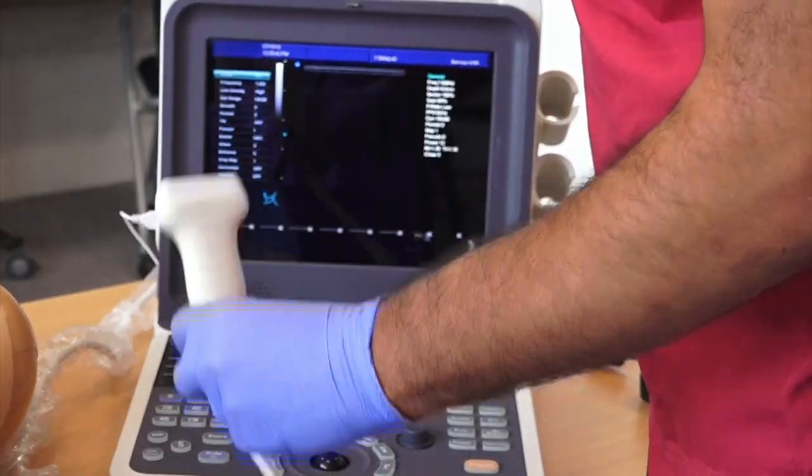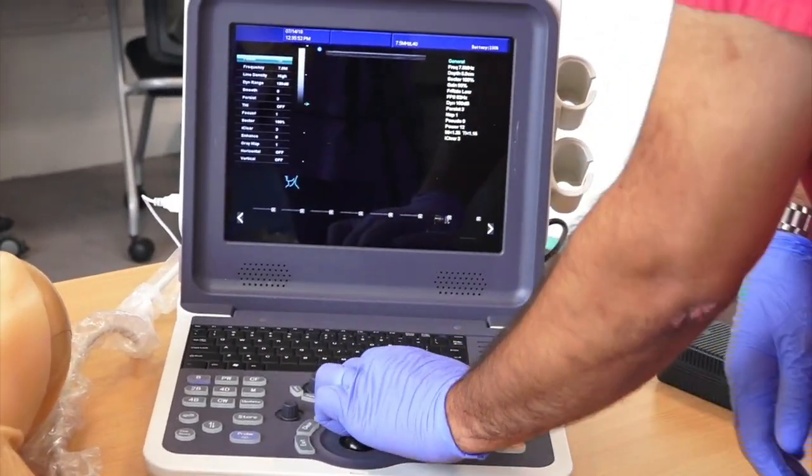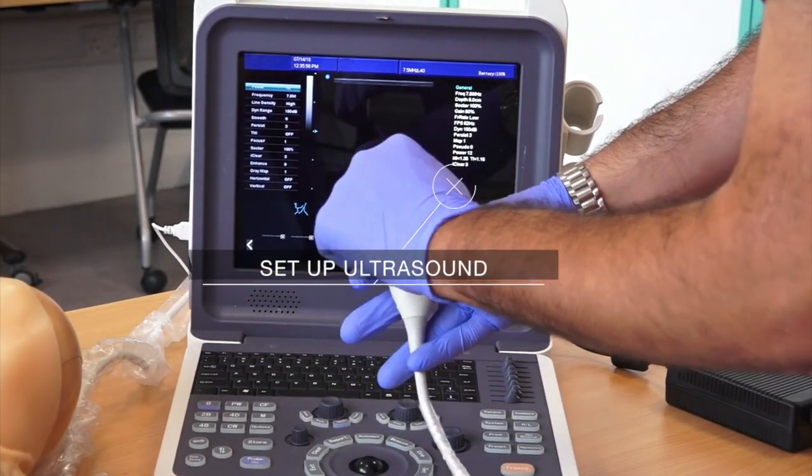Set up an ultrasound machine by positioning it near the head of the bed, plugging it in and turning it on, then setting an appropriate depth, focus, and gain.